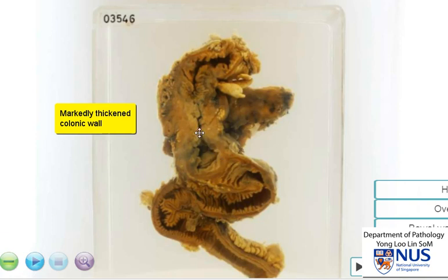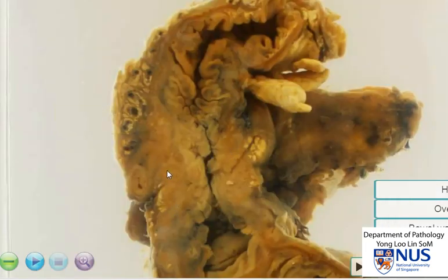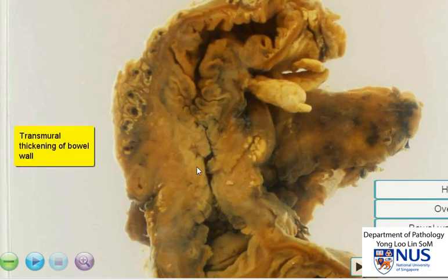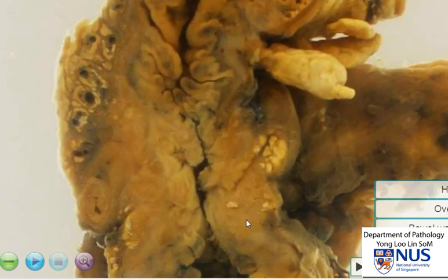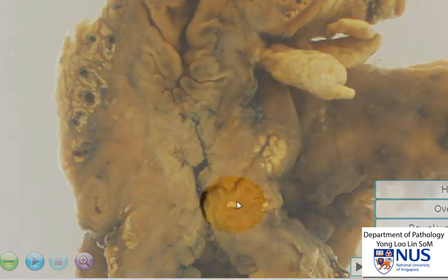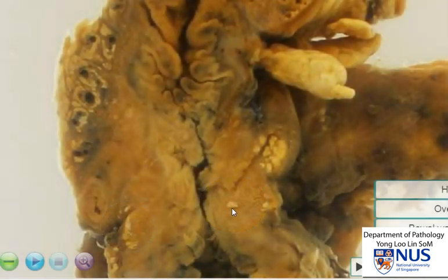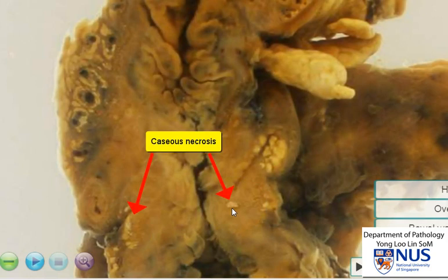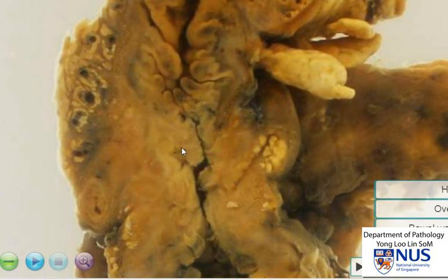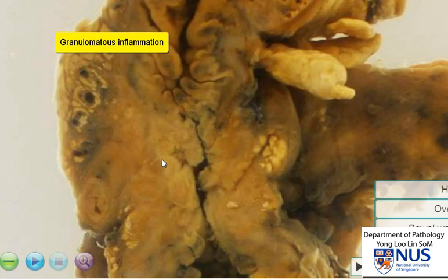Let's have a closer look. When we examine the wall of the large bowel, we can see that it is pretty much a transmural thickening with this ill-defined pale brownish area. If you look carefully, you can see that within this area there are some paler areas that are almost whitish in appearance and somewhat geographic. These represent areas of caseous necrosis, and these areas of thickening are due to numerous large confluent granulomas.